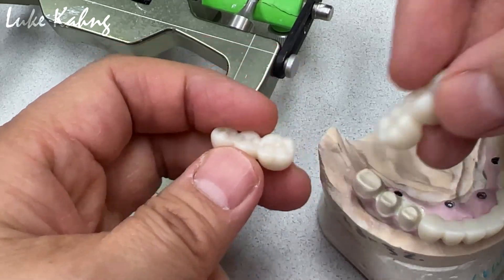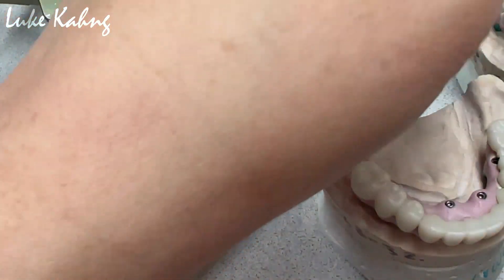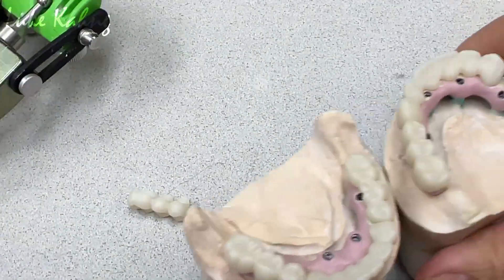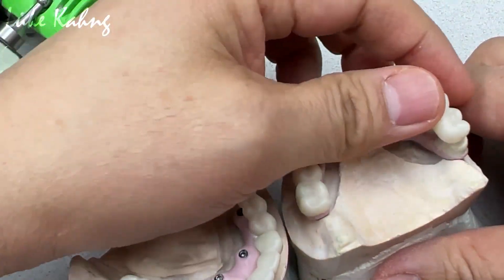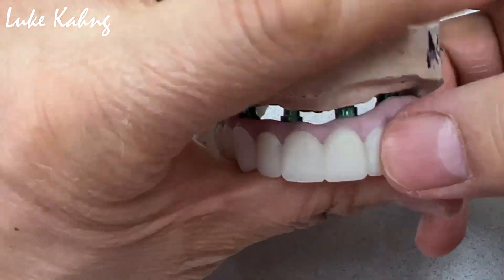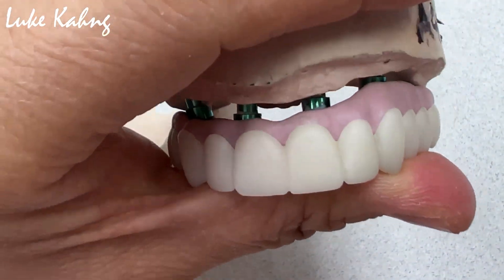So this 24-unit case — we're going to finish, apply porcelain underneath here, but coloring with the metal on the top of them.